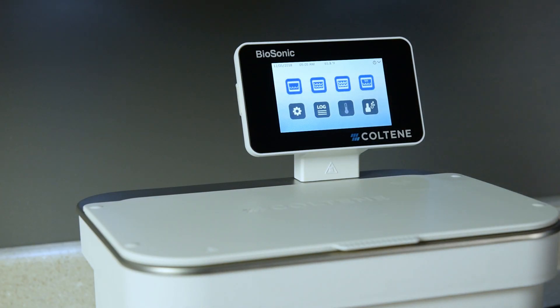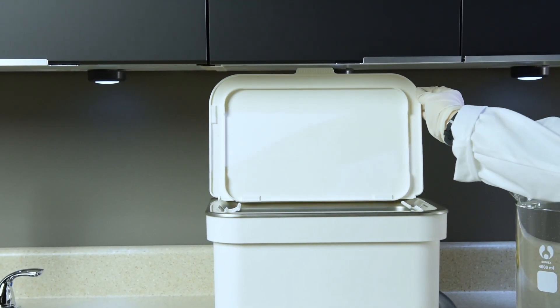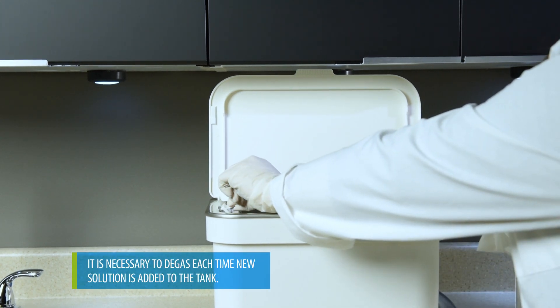The display will show the main screen in the language of your choice once setup is completed. Finally, degas the solution to eliminate large air bubbles that interfere with the cleaning process.